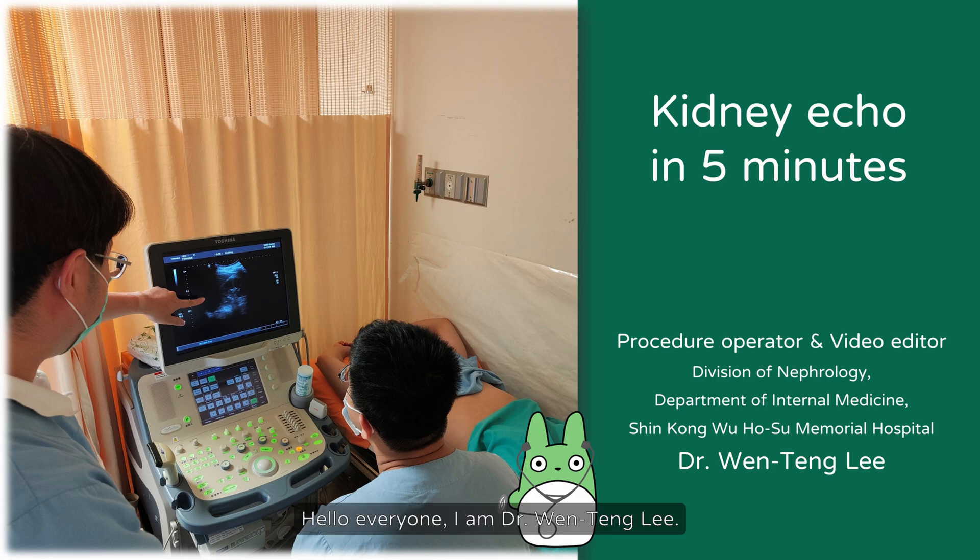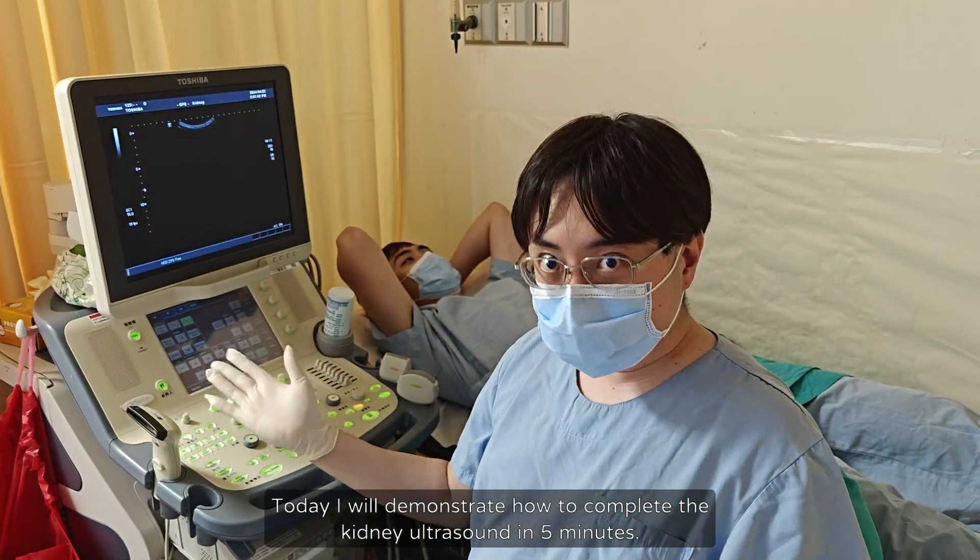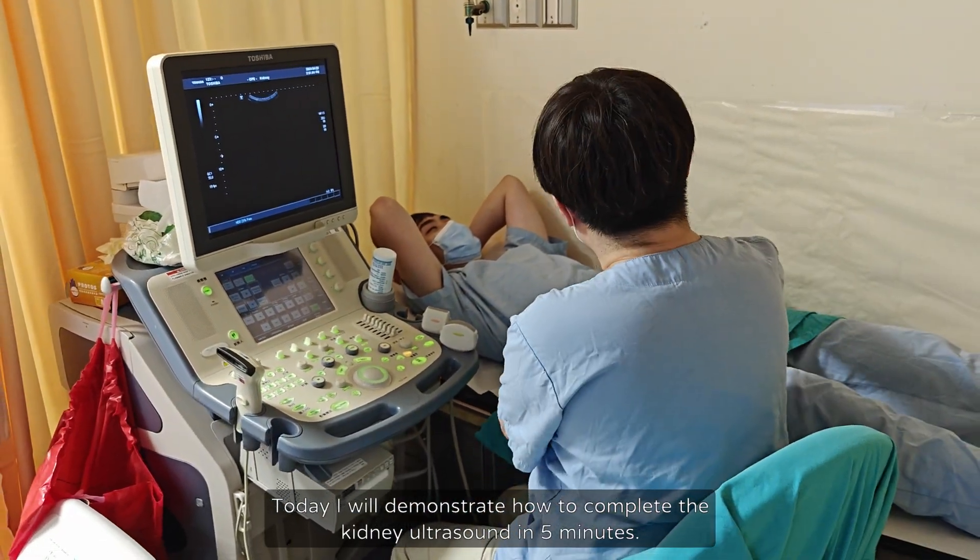Hello everyone, I am Dr. Wen Teng Li. Today I will demonstrate how to complete a kidney ultrasound in 5 minutes.